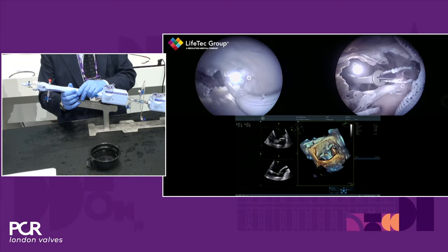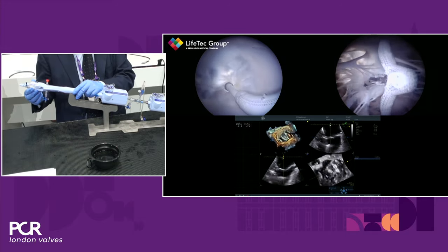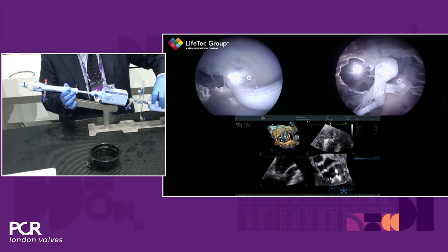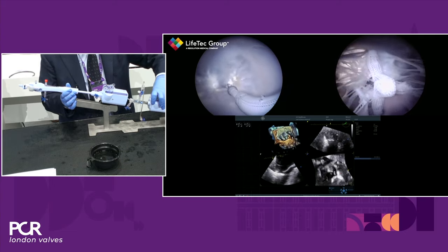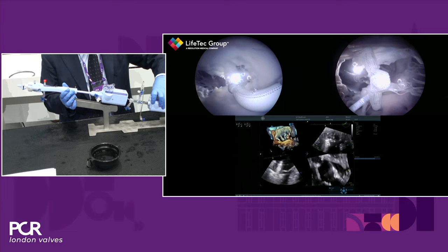Now Paolo is below the leaflet. The clip is again open. And now the next step is obviously to try to grasp enough anterior and posterior leaflet. In an anatomy like this, usually anterior is quite easy to grasp, while posterior, which is retracted and slightly shorter, could eventually be more difficult.